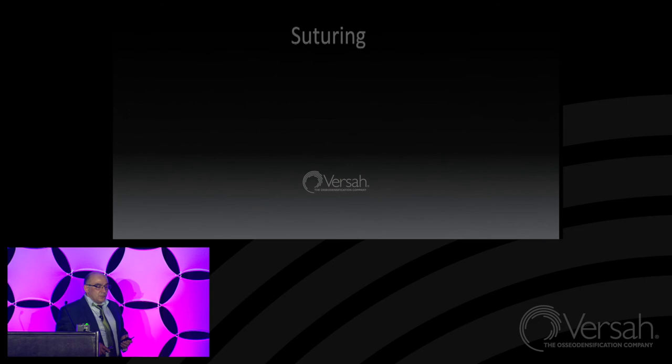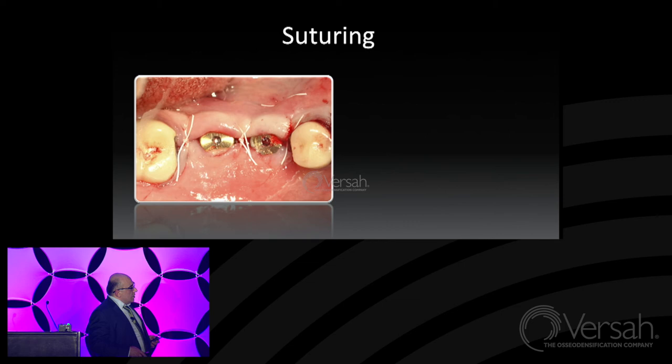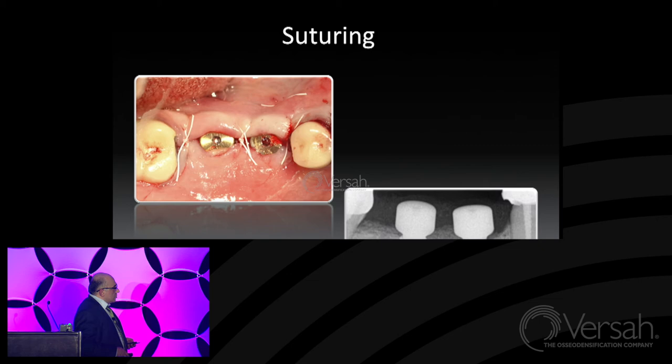Here it is. You can see here that we overlap our healing abutment with the lingual flap. And in this case, this healing abutment serves as a tent for this flap. Beneath the flap, during this period of waiting for 1 month, we will get a new amount of connective tissue, which will increase the amount of soft tissue around the implant. We'll see how it works. This is the control X-ray, of course.